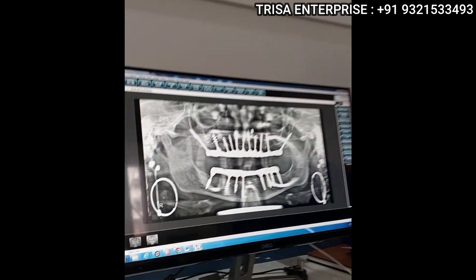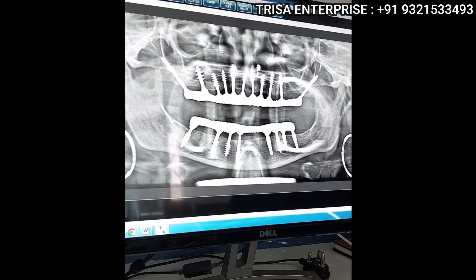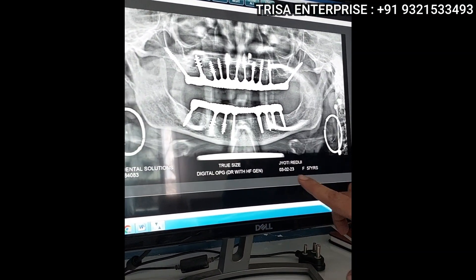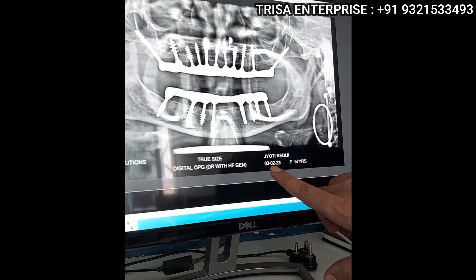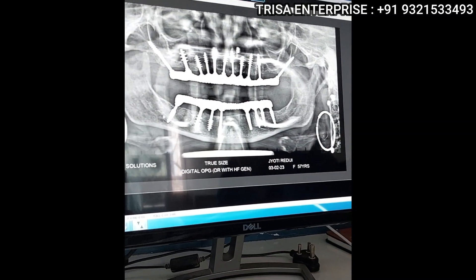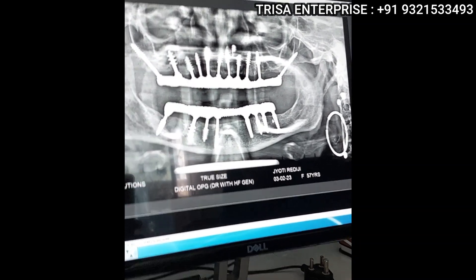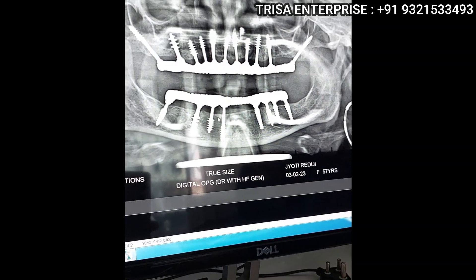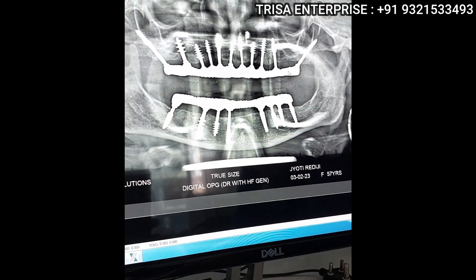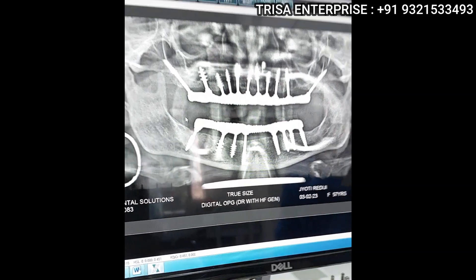I will show you the post-operative X-ray done today — today is the 3rd of February 2023. You can see the excellent healing around these implants. These are the compressive implants; you can see the bone healing and bone levels around them, and also the bone healing around the smooth surface implant.